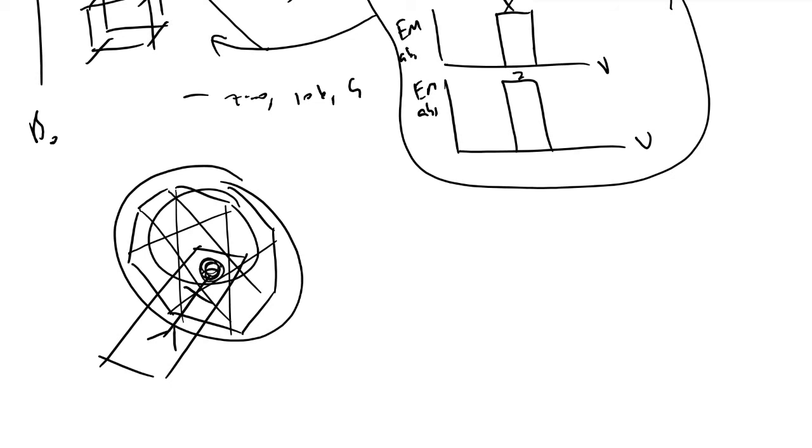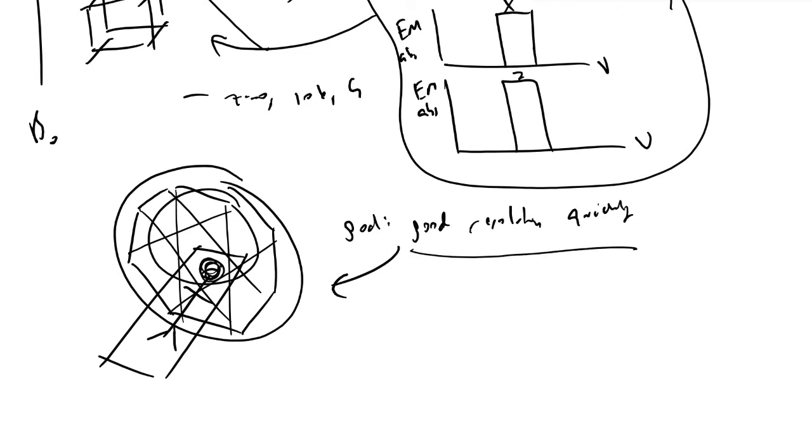And so if we just did this in one dimension, we would have a figure, but there wouldn't be high resolution. So our goal is to get good resolution, and we want to do it quickly. And the mechanisms by which you'll find in these hospital rooms where they've got these donuts that people go into, where we're taking multiple planes into account, not just three, provides us with additional information that allows us to make good resolution three-dimensional images of what's going on inside of living samples and people very quickly.